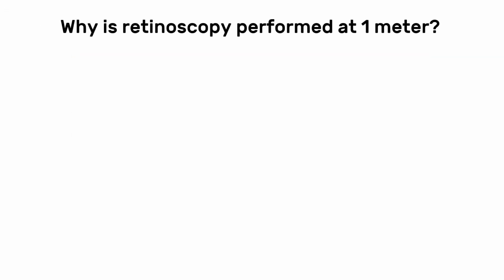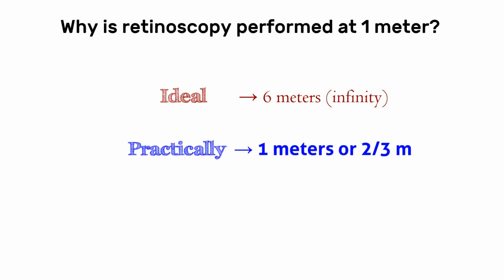In short, retinoscopy must be performed at 6 meter distance for the lenses needed to neutralize the reflex to be equivalent to the person's refractive error. A shorter working distance is selected for practicality, and hence a distance correction factor must be applied.